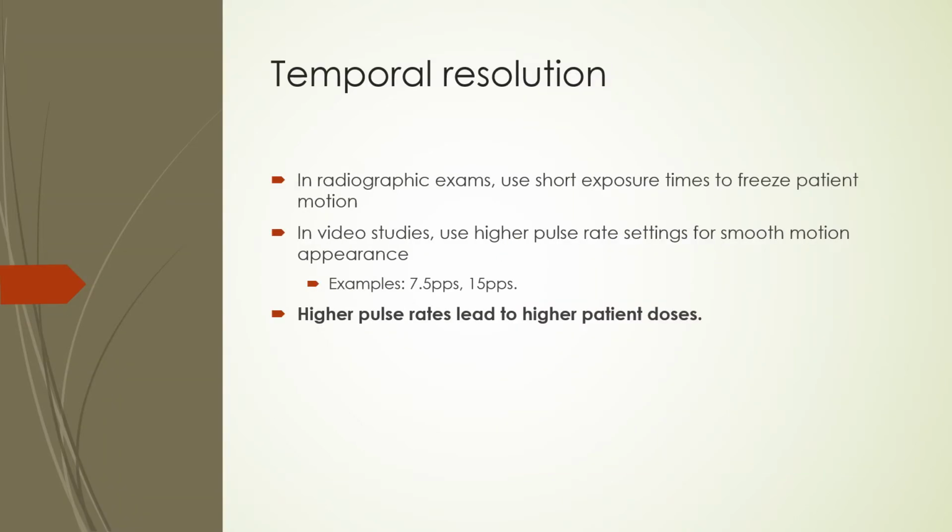Temporal resolution is also important in radiography. In radiographic imaging where moving structures are part of the image, a short exposure time is always desired so as to freeze the motion. This may also require a higher tube current.